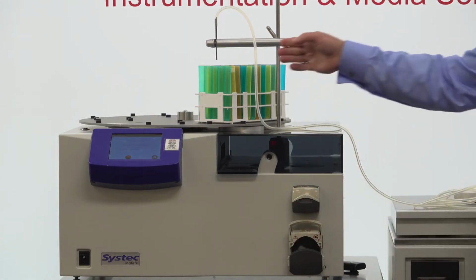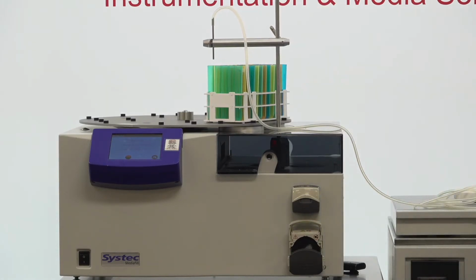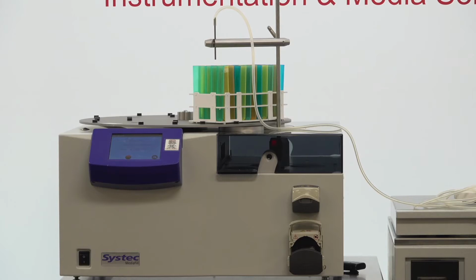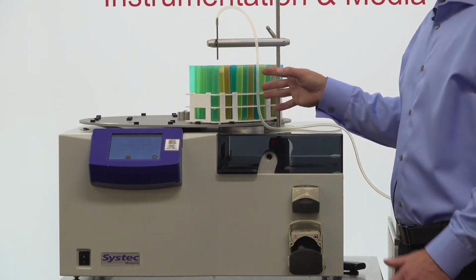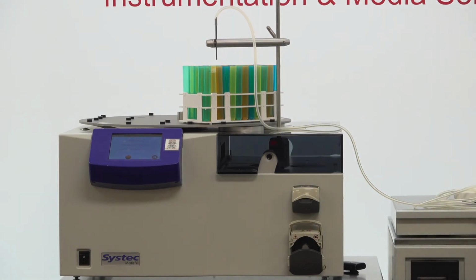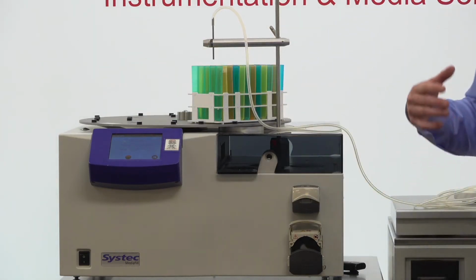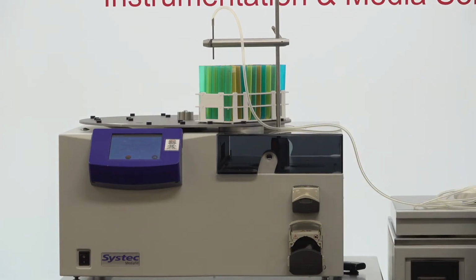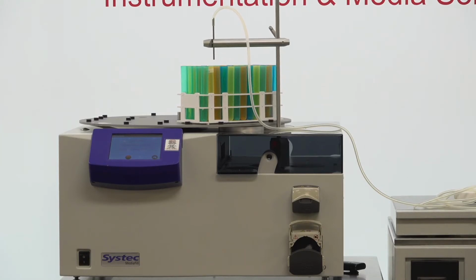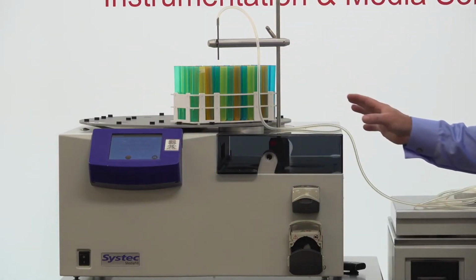So it will move on these various axes and go through each and every tube. We can program the number of racks that we want to fill, and then it would just go right through every single tube, fill all of them, move to the next rack. The benefit of this is that once this first rack is filled, if you need to remove that for capping or to change any of the tubes out to put another rack on, it's not moving very fast, so we can do that in the middle of the cycle itself once this rack is finished. So we could run this basically just on a permanent mode and just put new racks up and it'd be continually filling tubes.